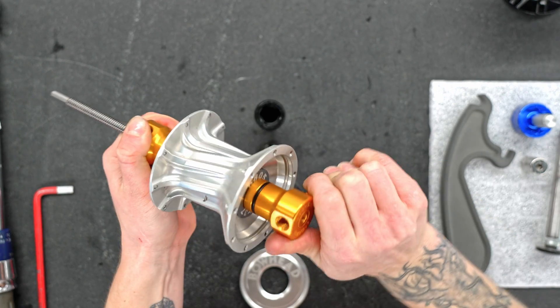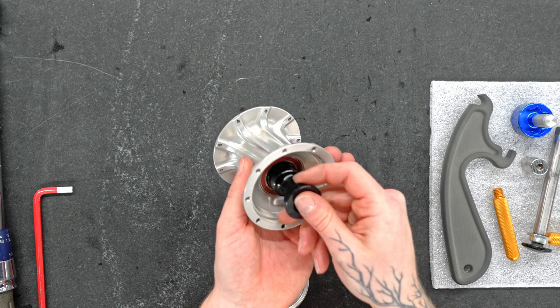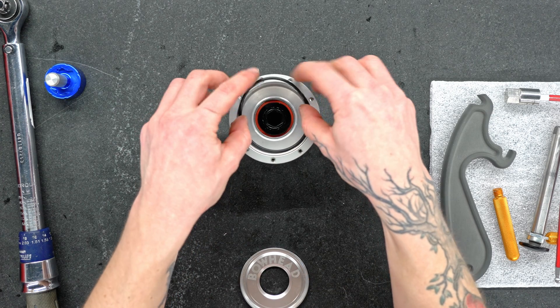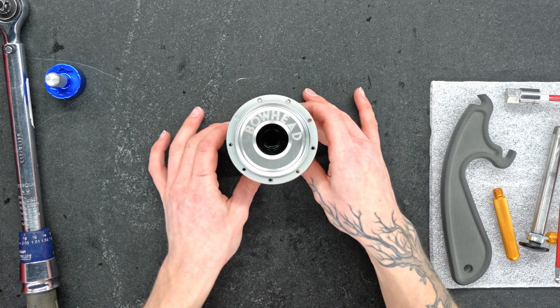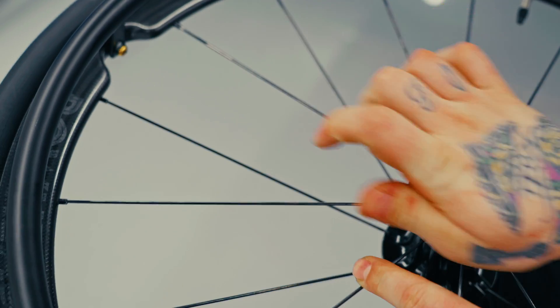Our third key feature is our serviceable hubs. We've designed these with Enduro bearings for longevity, reliability, and serviceability. They're made with 440C, which is the highest grade stainless steel, so they are ready for any environment — wet, dry, dirty, dusty, you name it, these bearings are up for it. They're like a fine wine — you get better with age.